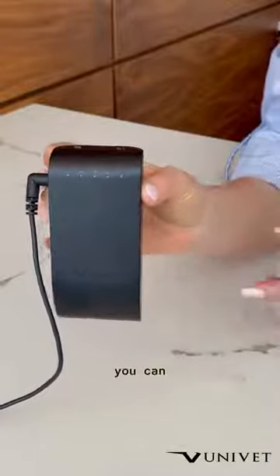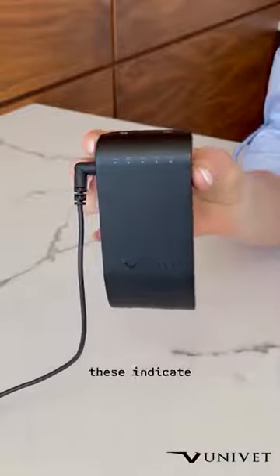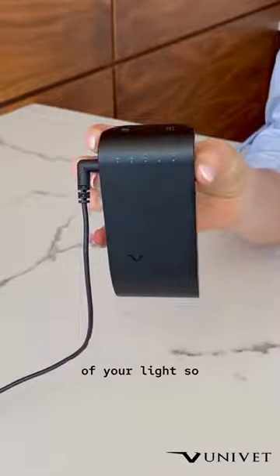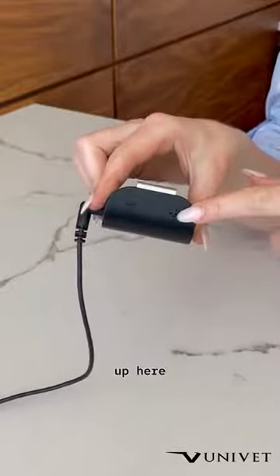With the light on, you can clearly see here that there are five blue dots, and these indicate the intensity of your light. You can adjust the intensity just using these two buttons up here.